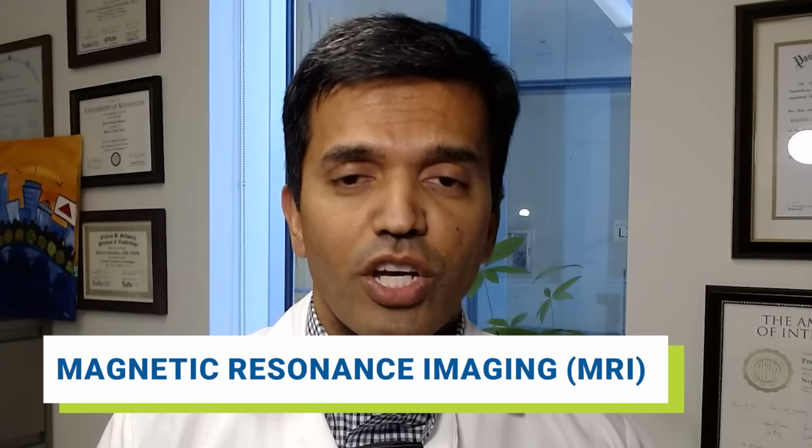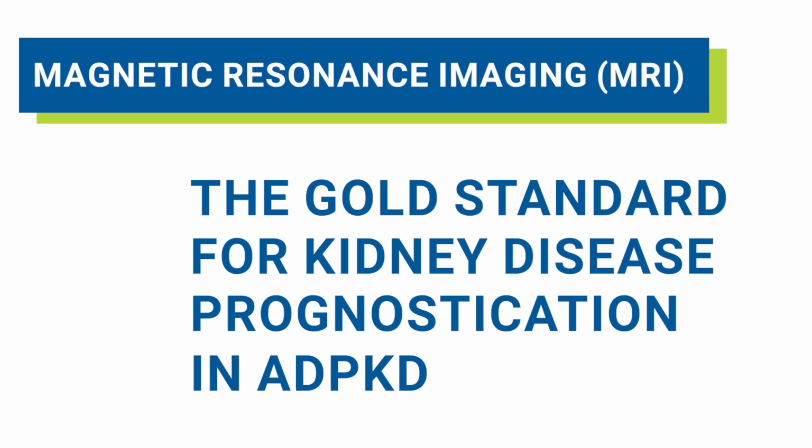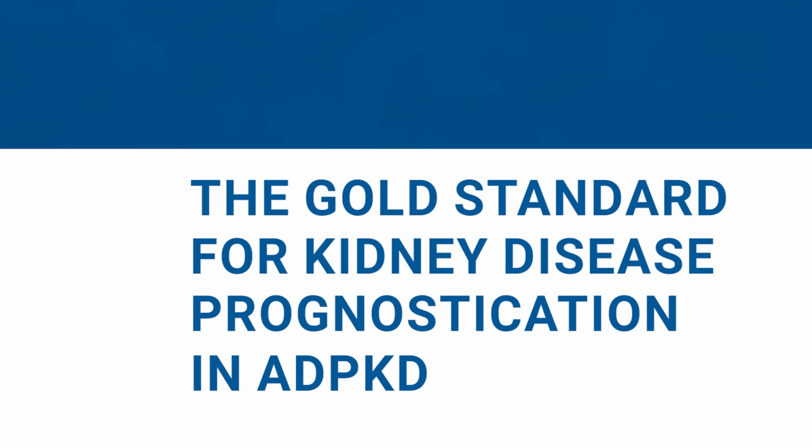Magnetic resonance imaging, or MRIs, have become especially important and the gold standard for kidney disease prognostication in ADPKD. We can not only tell the size of the kidney, but also the volume of the kidney, which we know is incredibly important in understanding which patients are likely to develop kidney disease in the future. In addition, the MRI can also look at patients' liver and pancreas, which are organs where cysts can develop in people with PKD.